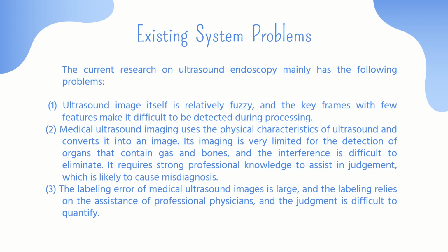Coming to the existing system problems, some of the problems which are present in the existing system are: this ultrasound imaging can be very challenging to process because of its relatively fuzzy quality, and the difficulty of detecting keyframes will be very large because it has very few features.